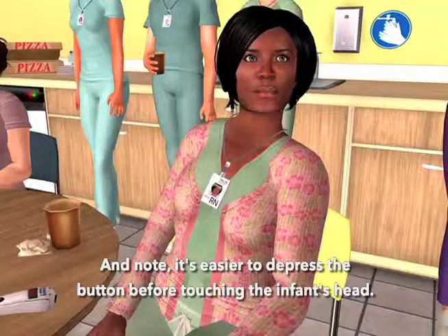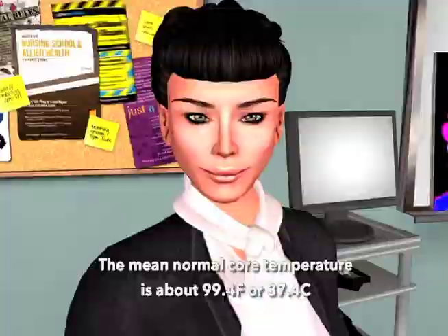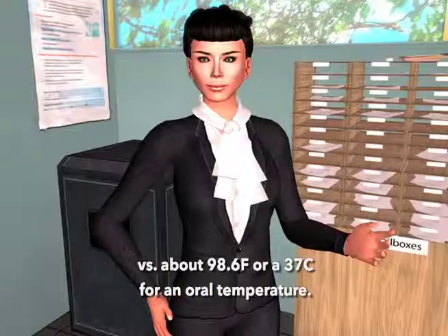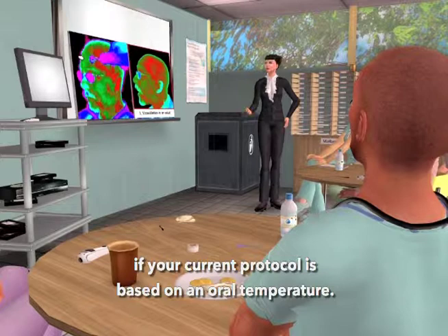The temporal scanner is measuring core temperature, about one degree Fahrenheit or half a degree Celsius higher than an oral temperature. The mean normal core temperature is about 99.4°F or 37.4°C, versus about 98.6°F or 37°C for an oral temperature. Your fever protocol will need to be adjusted upwards if your current protocol is based on an oral temperature. The temporal scanner is also available in an oral equivalent calibration — no adjustment in the oral-based fever protocol is required if you're using that calibrated model.